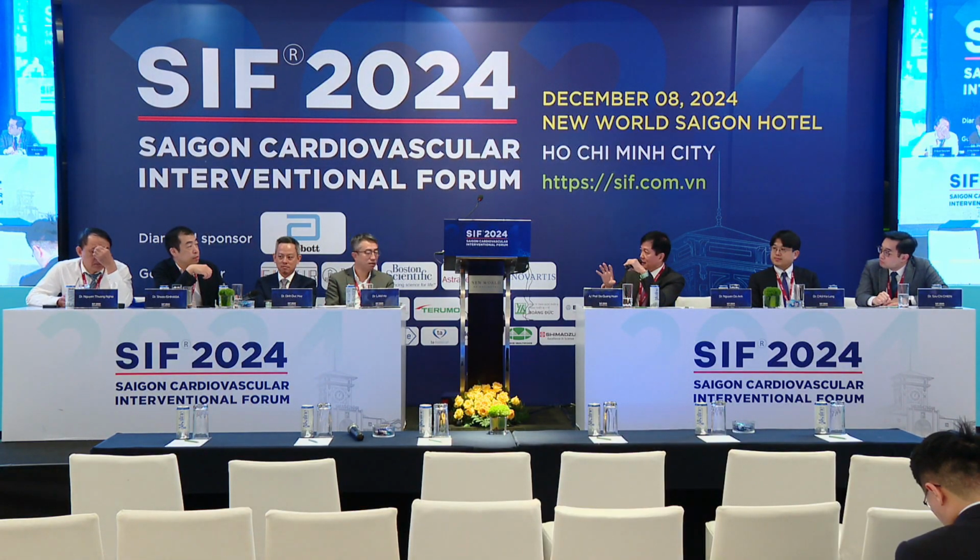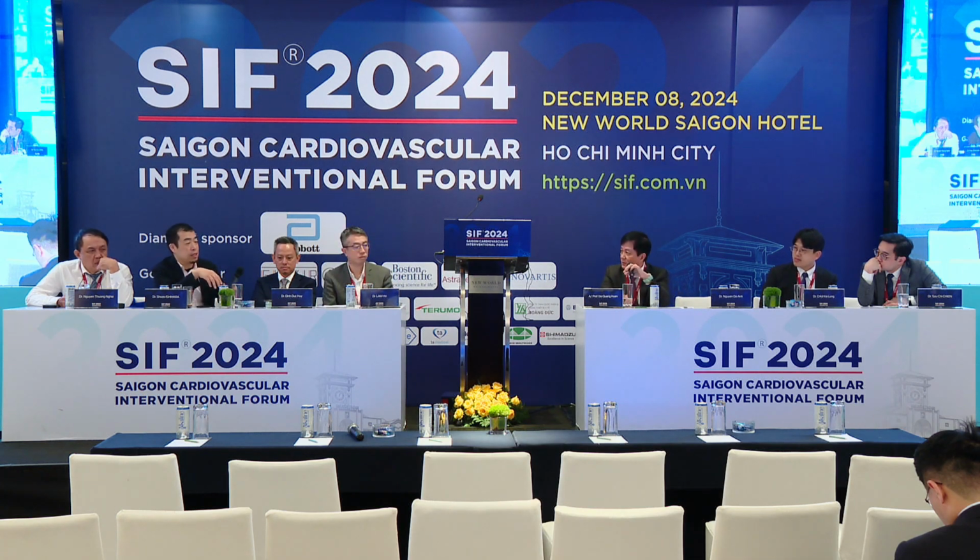If the area of myocardium is more than 10% of the whole heart, we should do the PCI. And first we use a small burr. We define a small vessel as one of 2.5 mm. If the vessel is 2.5 mm, normally we use the 1.25 burr the first time. And DCB is also one option.